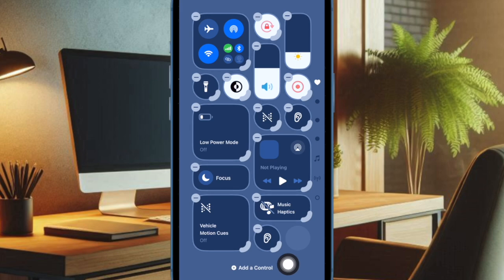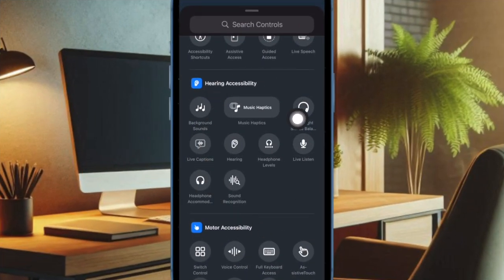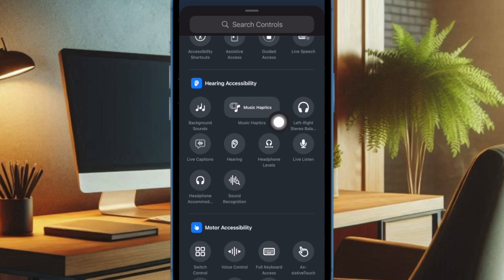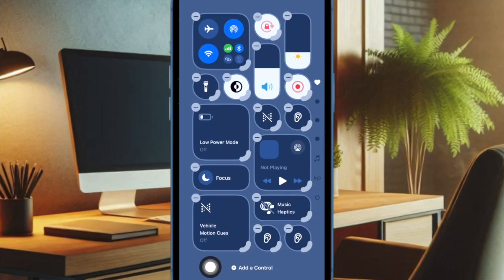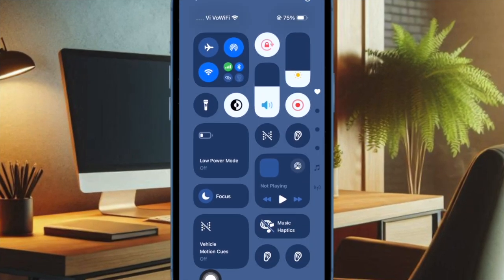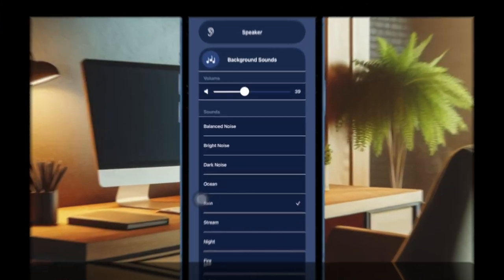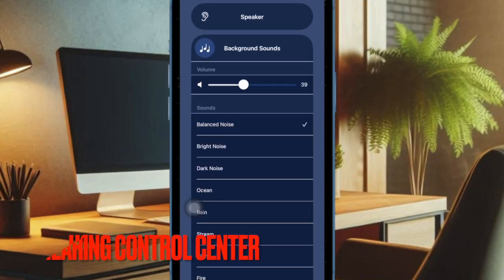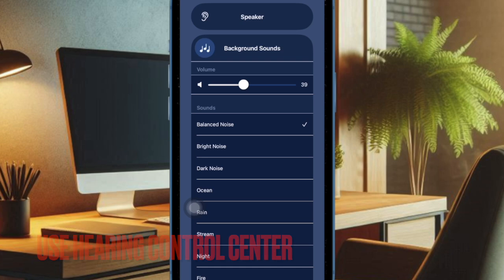Then scroll down to find the Hearing Accessibility section and tap on the hearing icon to add it to the Control Center. Then tap on the empty area of the screen to finish.